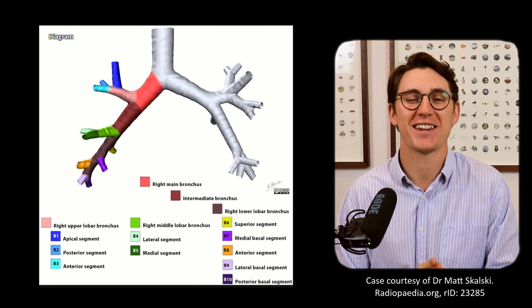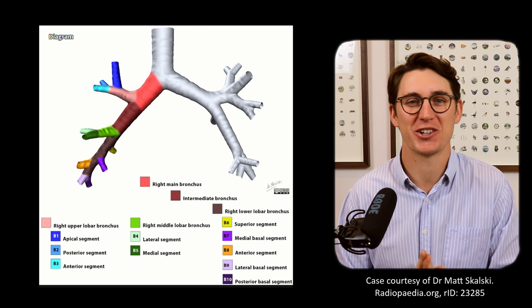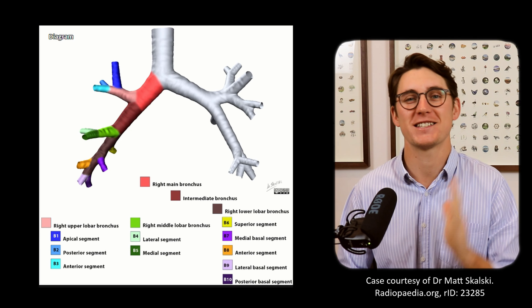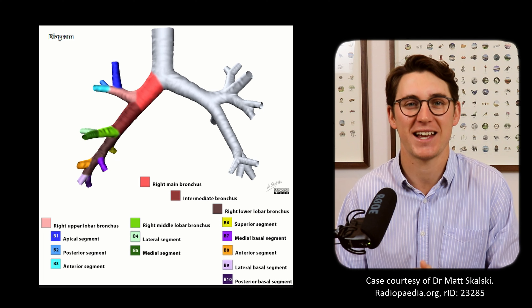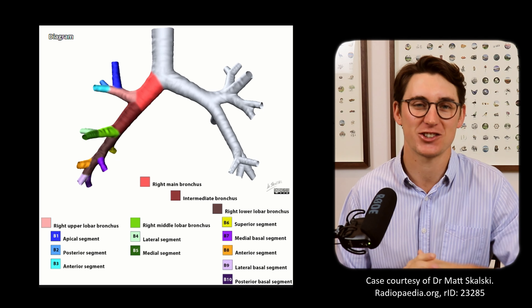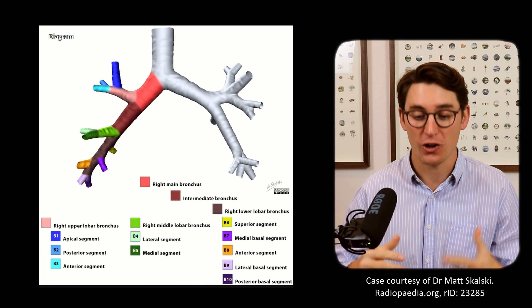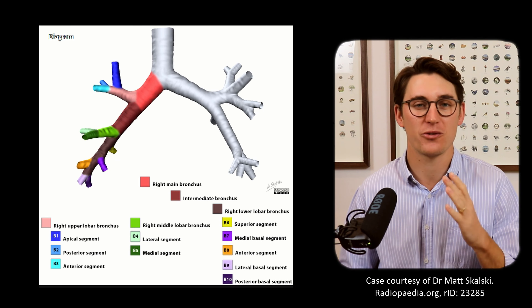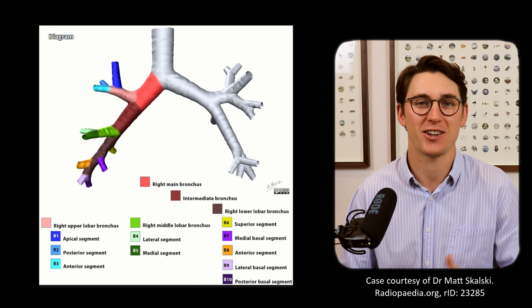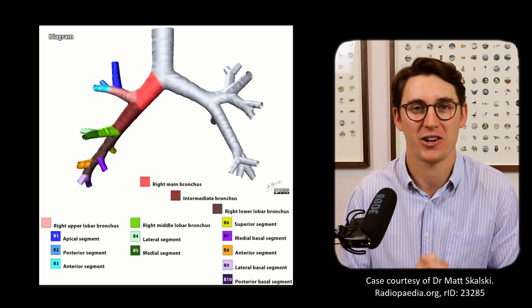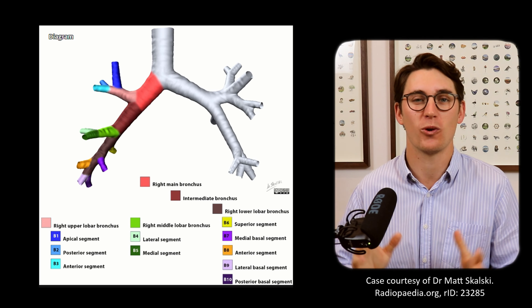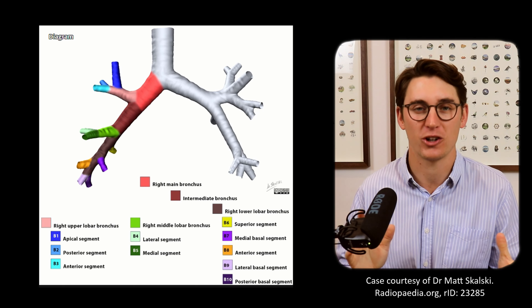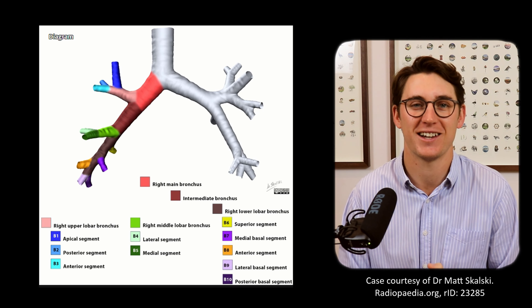Hello everybody and welcome back to another anatomy tutorial. Today we're going to be covering the lobar and segmental anatomy of the lungs on a CT scan. We're going to follow the bronchopulmonary tree through the first, second and third order bronchi. I'm going to show you where they course, how to name them, and how they branch off within the lungs.